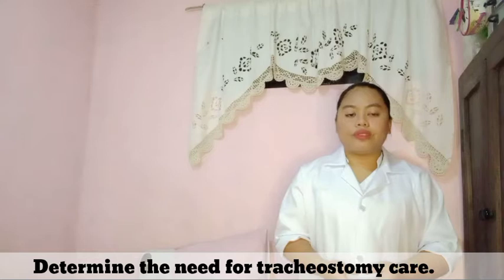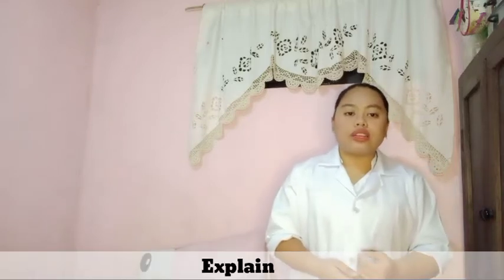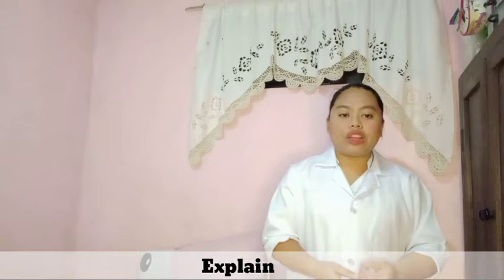Determine the need for tracheostomy care. Tracheostomy care is usually done 2 to 3 times per day. Explain what you are going to do and the reason to the patient even if the patient does not appear to be alert.